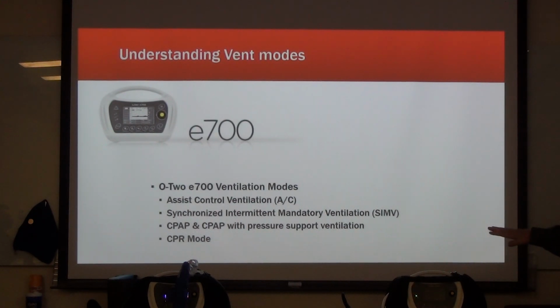And then we get CPAP, which we've all been using, right? But now we'll have this ability. And this afternoon, guess what? You'll actually be able to put these CPAPs on with masks that we have for you, so you can play with it and feel what it feels like to be on CPAP, which I'm on every night, by the way. I don't know if anybody does CPAP. Here we go. Yesterday we had one. He was actually doing BiPAP for central sleep apnea. So I think he was doing a 20 over 10 on it. And I'll explain what that is in just a little while when we get to that mode.